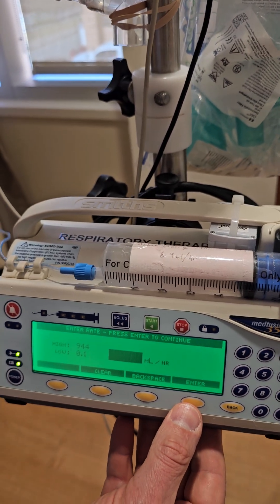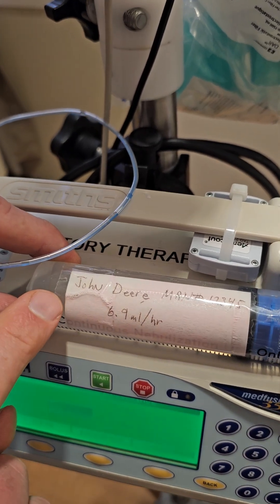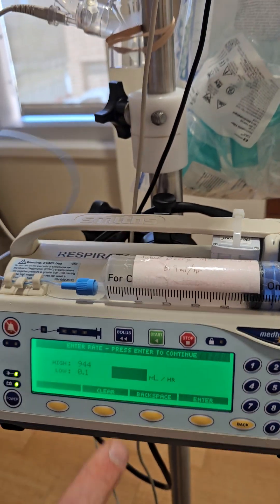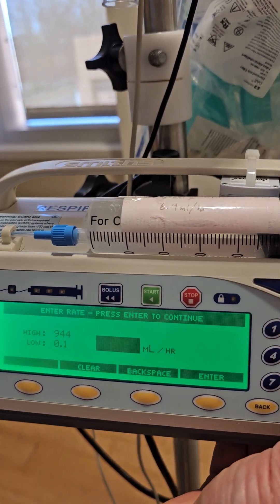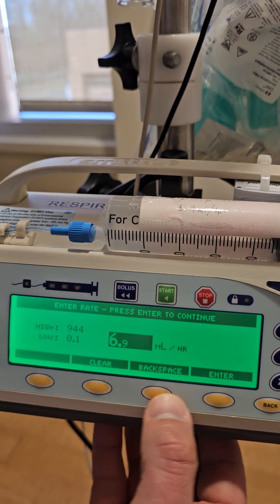Now we need to enter the dose per hour. This can be found in the MAR — it's on the order for Flolan and also on the label of the syringe. Mr. John Doe here has a rate of 6.9 milliliters per hour ordered. We'll enter 6.9 and press enter.